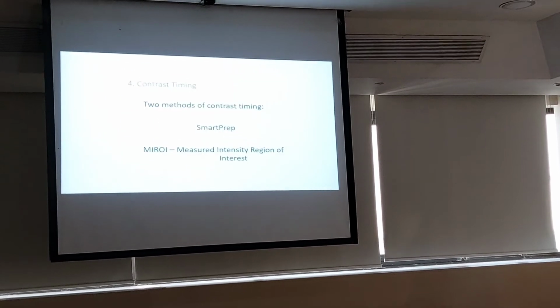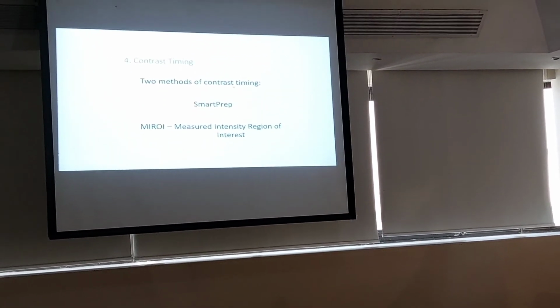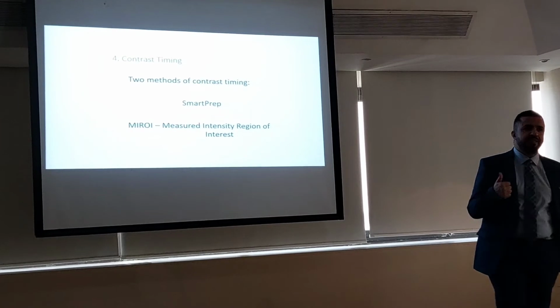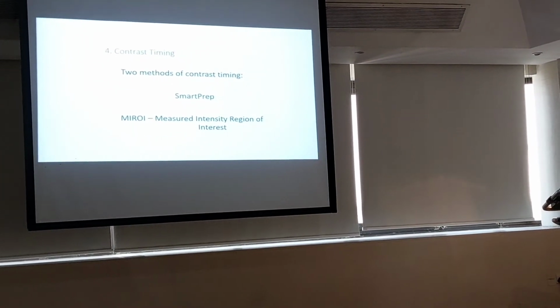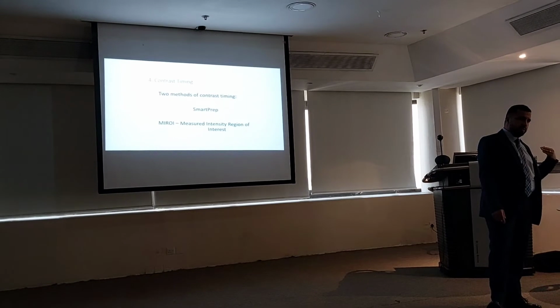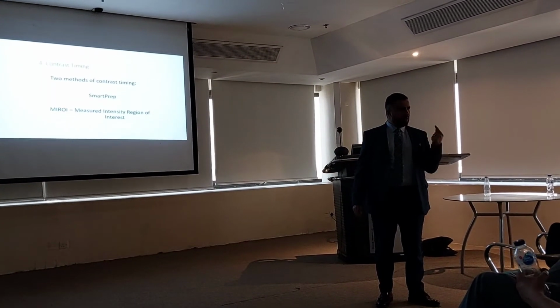Now we have the contrast. We have two ways to do contrast: either SmartPrep or timing bolus. Both of them are okay. Me personally, I prefer the timing bolus. That's because of only one reason.